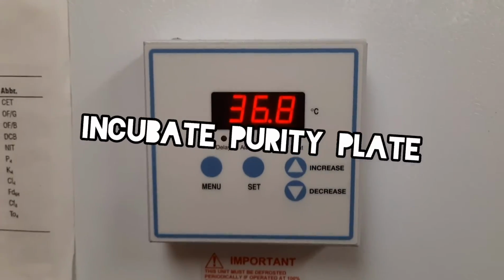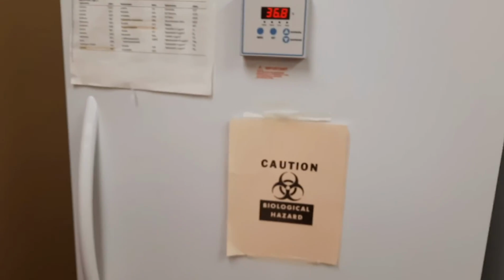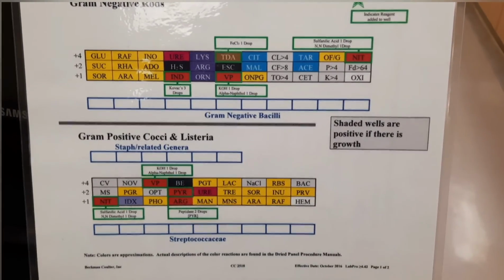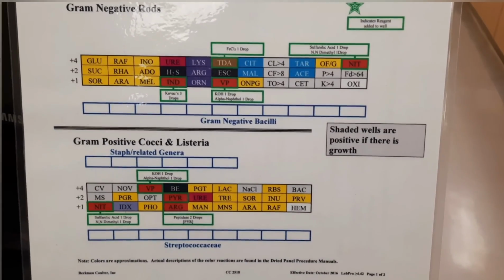Don't forget to place your purity plate in an appropriate incubator. Make sure to always check your purity plate when interpreting results. Results should automatically be uploaded to the LabPro software. Results can be read manually using a light box.